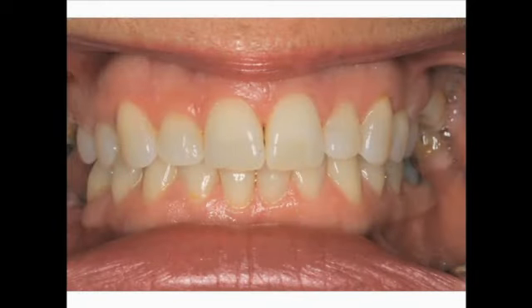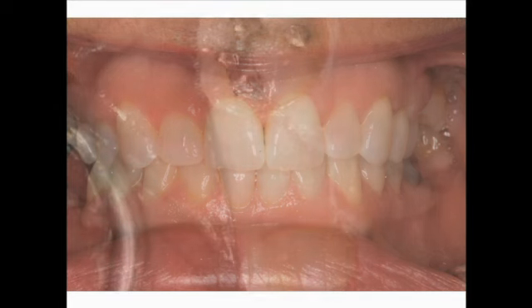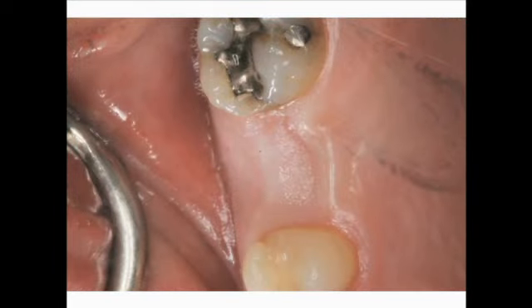Here's a view of the retracted smile. Our patient missed her maxillary first molars because it made her feel less than whole, less than ideal. Here's an occlusal view of the number 3 area. It appears clinically that we do have adequate width of bone, but the CT will give us an exact interpretation of the amount of bone we really have.